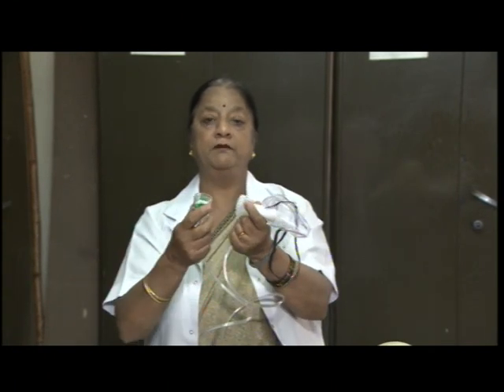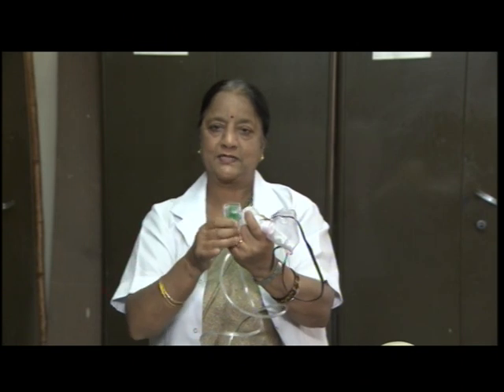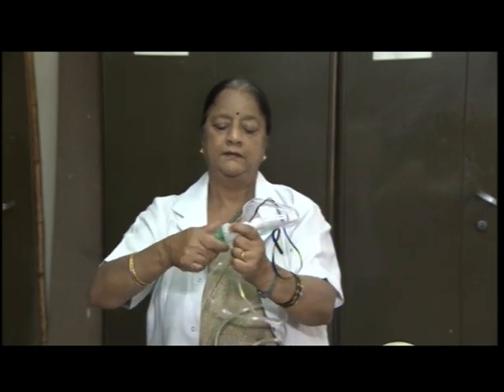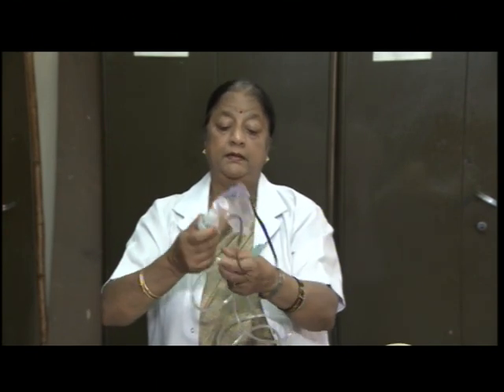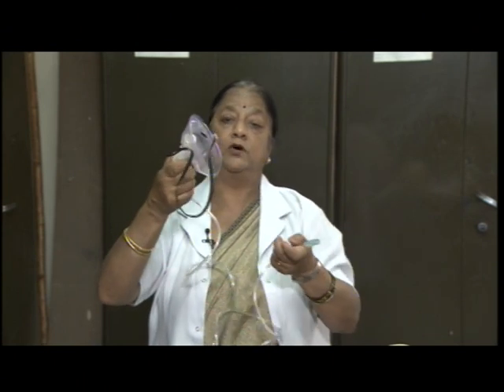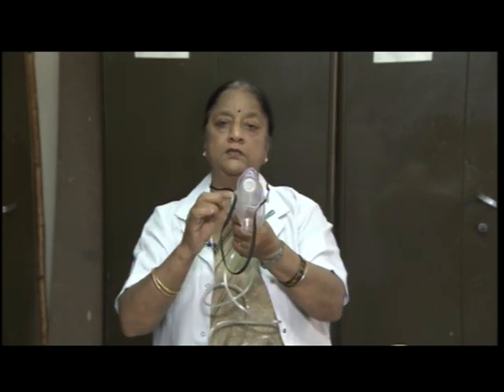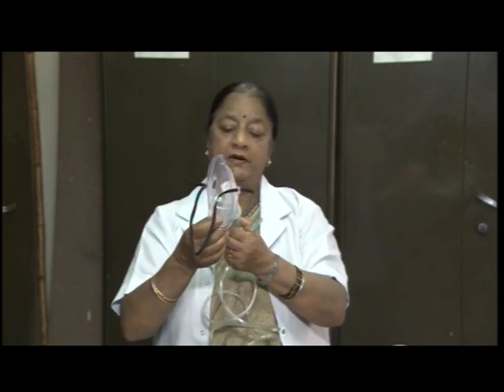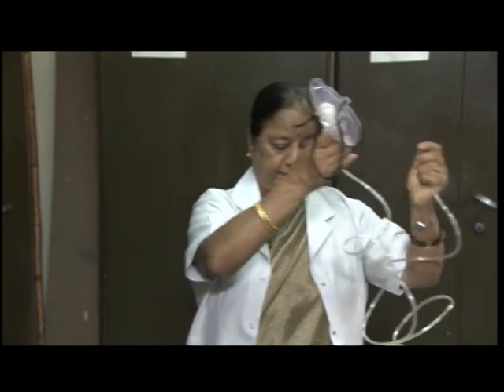Those patients who have a breathing problem, asthma problem, are ordered some medications that are put in this cup, and it is closed. It is called nebulization, and the patient is attached to the oxygen source, and the required amount of the medicine goes through the inhalation. The person inhales by way of putting the mask on the patient's nose.